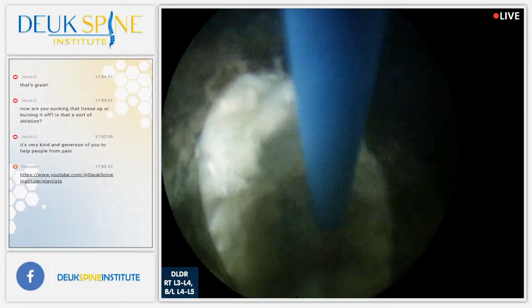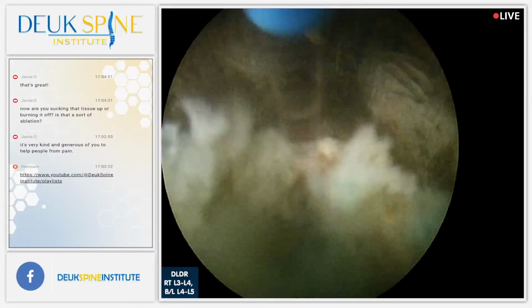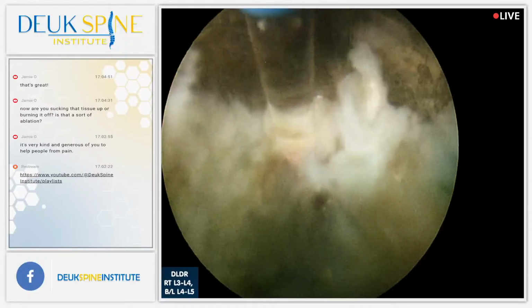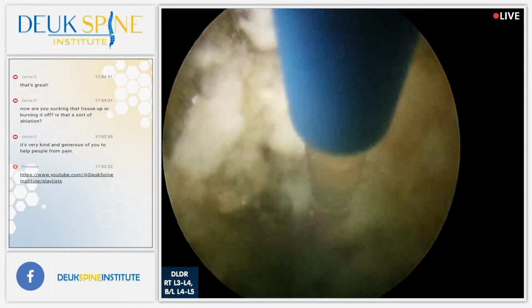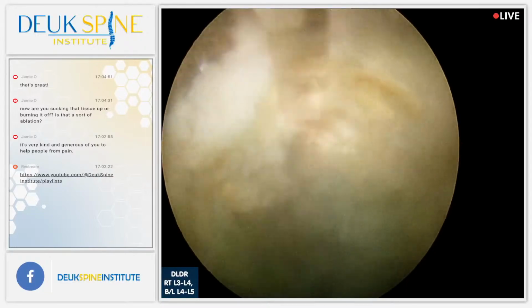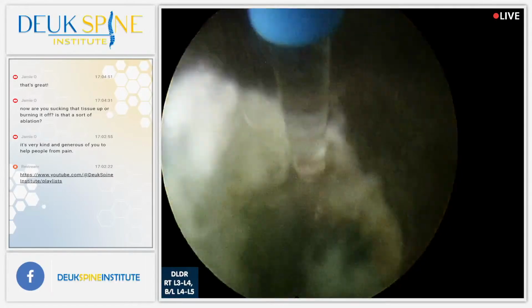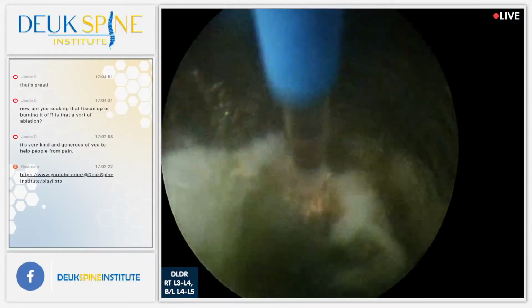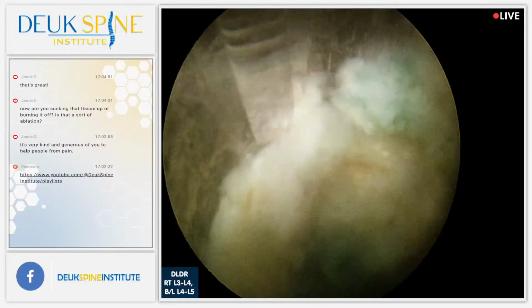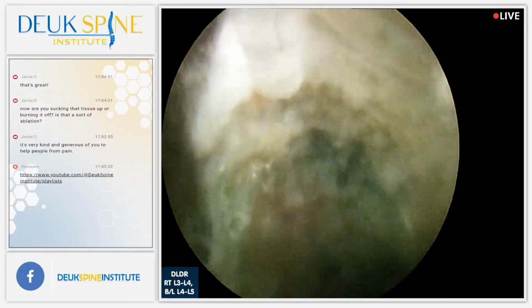And now you have our final patient, a local lady who has 3 disc herniations, 2 at L4-5 and 1 at L3-4. And now we're just finishing. She had horrible pain in her legs from the nerves being pinched by the herniations. We're here removing the herniations. This is the last of them. And we've gotten rid of probably 80% of the herniation. Very nice. She's going to do fantastic. How do I know? Because we've done this thousands of times. We know. We've seen the results.